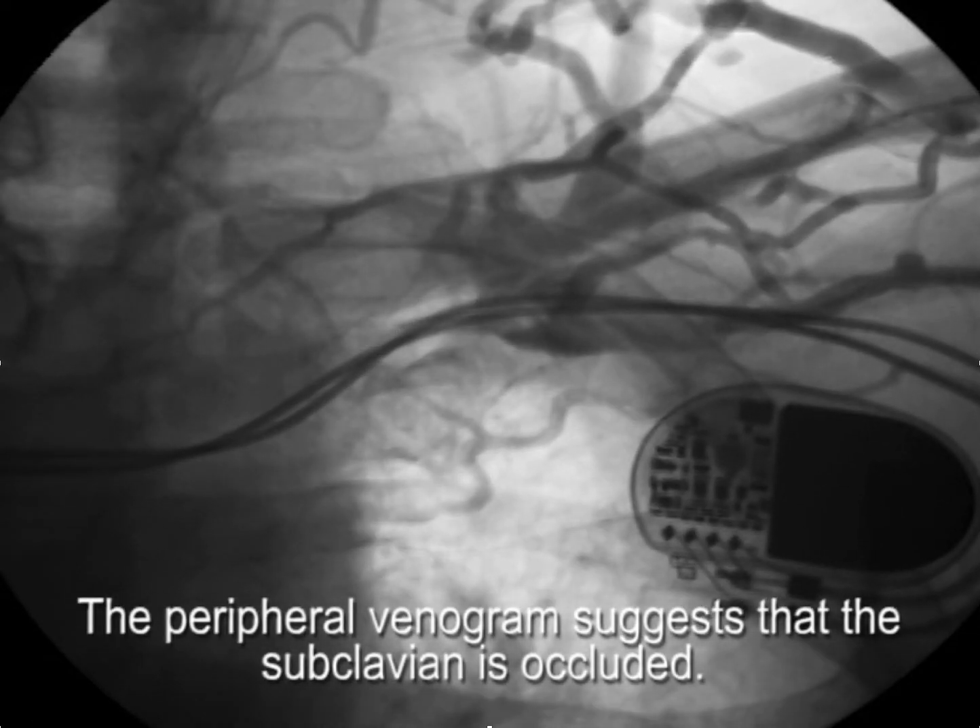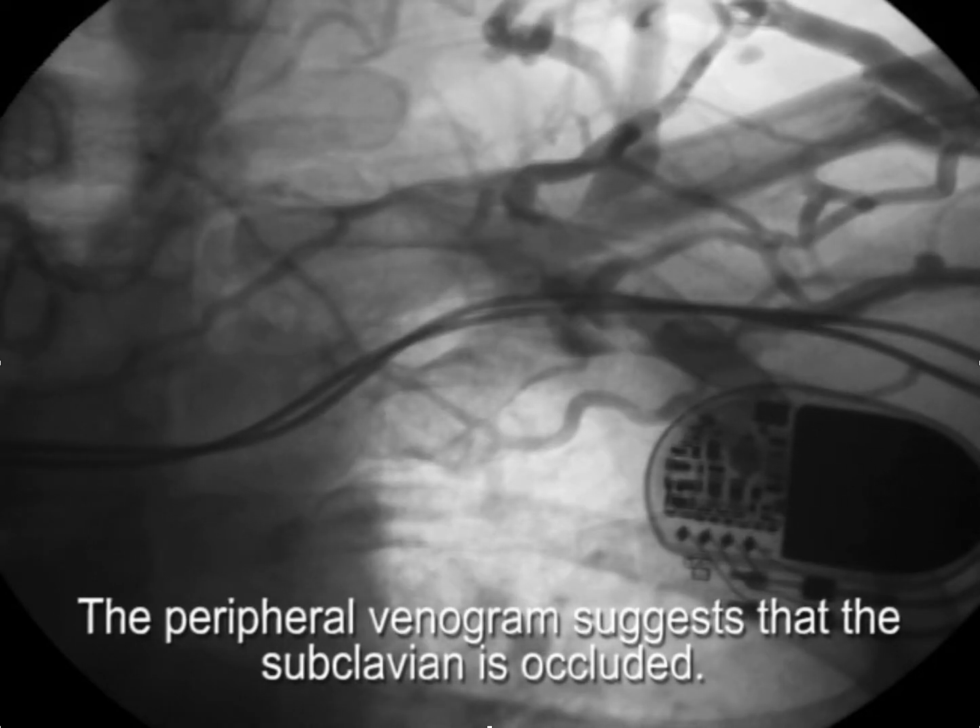The initial impression is that the vein is occluded, and maybe we should just go to the other side. What we've learned is that oftentimes the peripheral venogram — and any other mechanism or means by which to judge whether the vein is open or not, such as ultrasound or CAT scan — overestimates the severity of the problem.